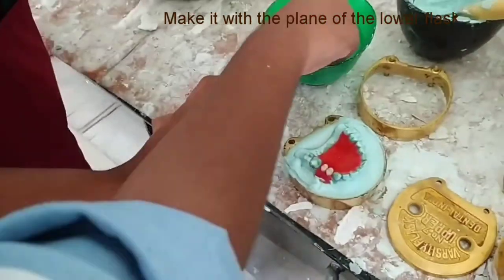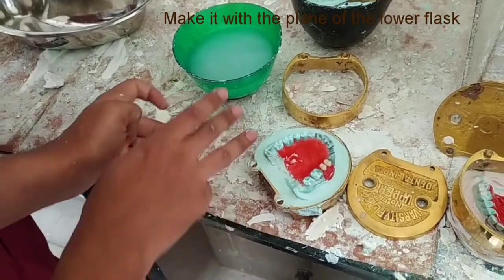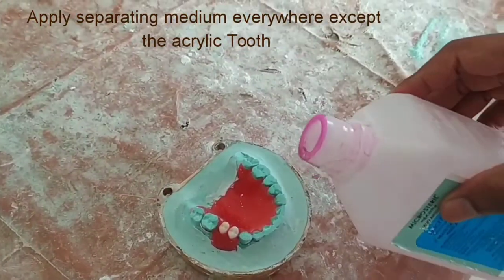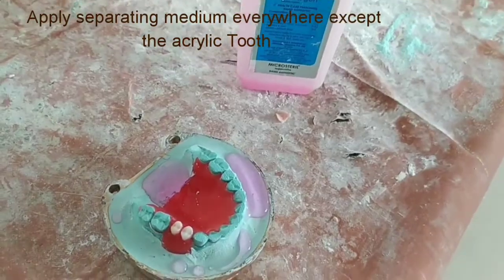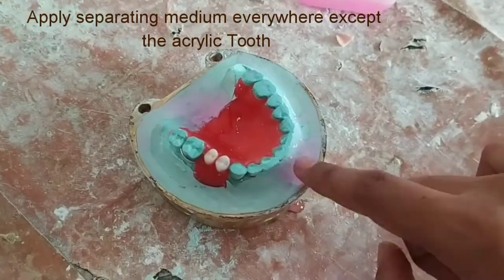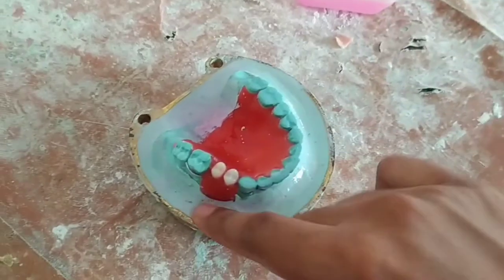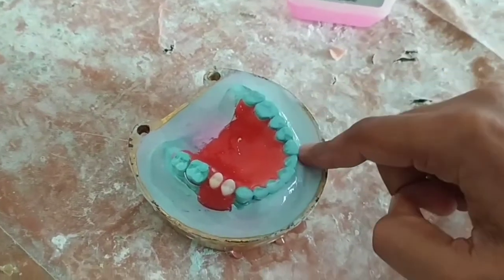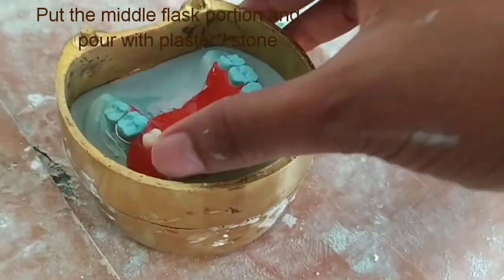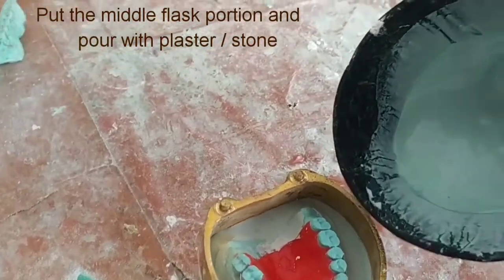Remove the excess material and make it level with the flask, then allow it to set for some time. After this we will add the separating medium — you can use a brush for applying it everywhere except on the acrylic tooth, because we want it to be fixed in the plaster. Then pour the middle portion with plaster.